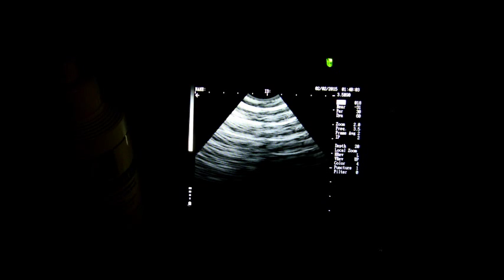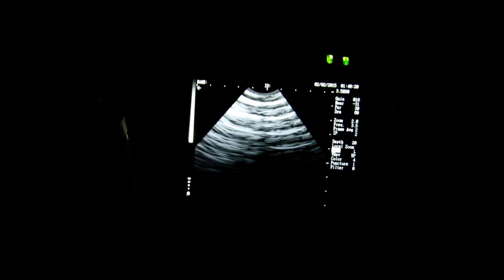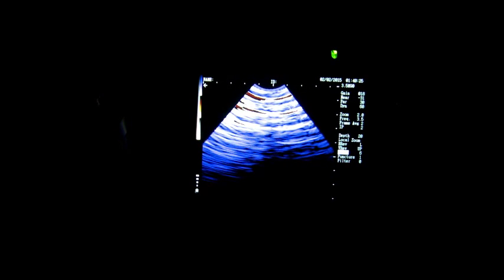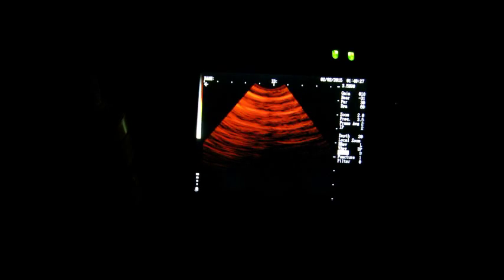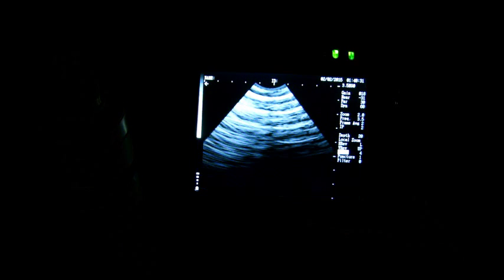Your eyes can pick up some things in colour better than they can in black and white, and it's for this reason that some people like to use the pseudo colour option, which is available on all of your ultrasound systems. On the MSU, you simply navigate down to colour, and with the left and right arrows you can give your image a colour wash, which, as I say, can help you to pick out some things a little bit easier than just a plain black and white image.